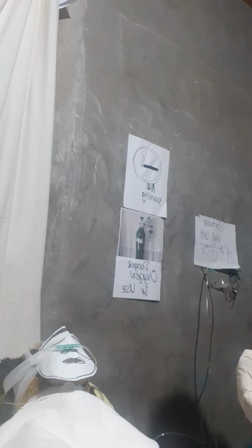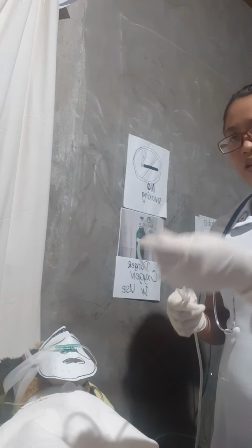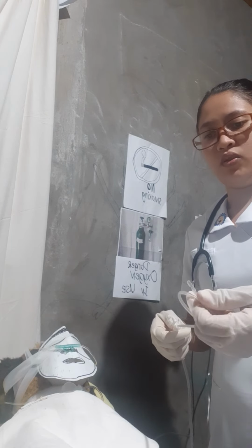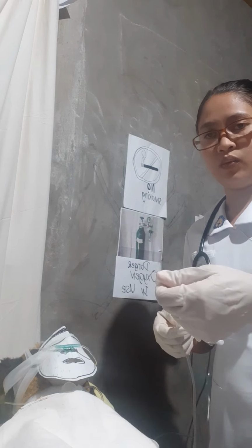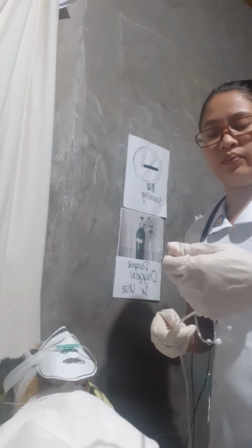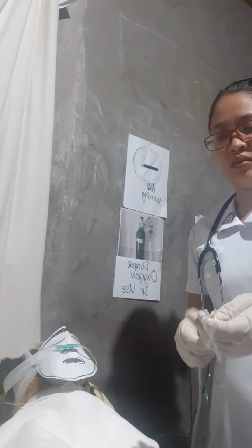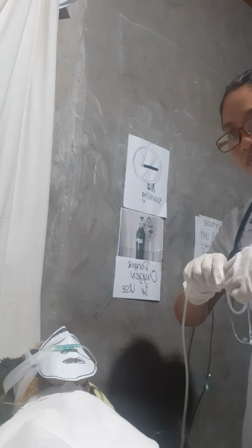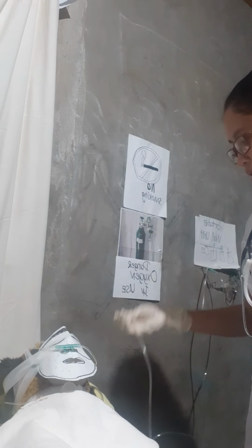And next, we need to wrap the sterile catheter into the dominant hand with sterile gloves. Then untouched.